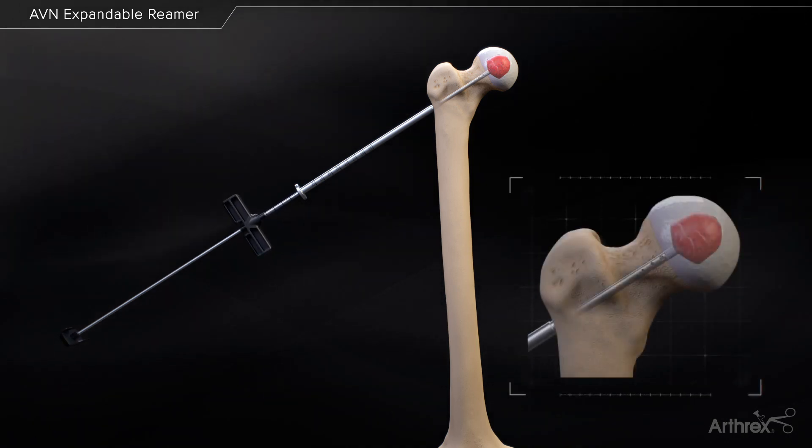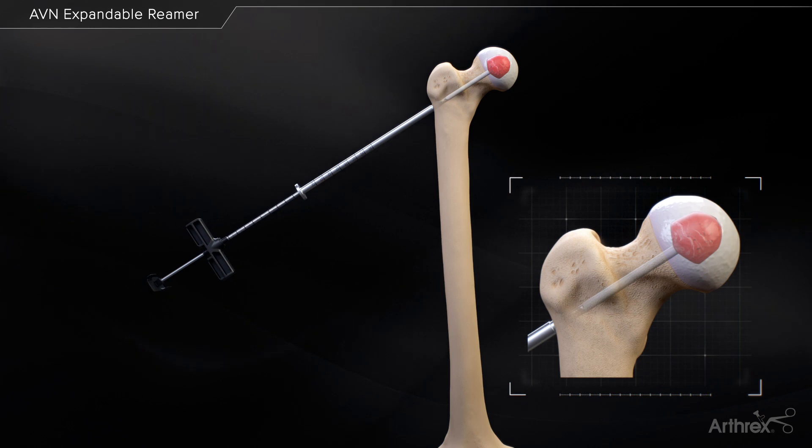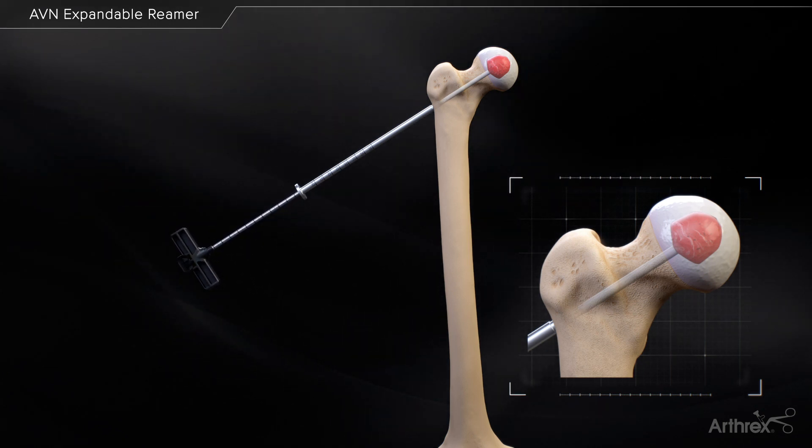As the cement is being expelled, slowly retract the delivery cannula to backfill the entire length of the drilled socket.